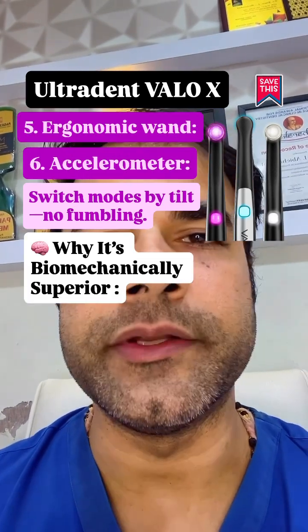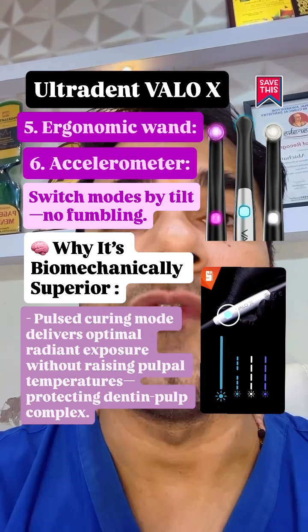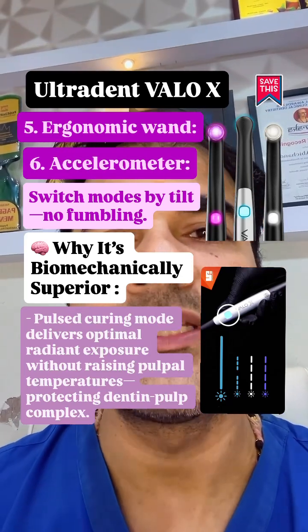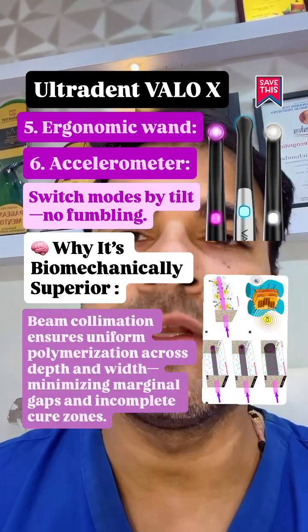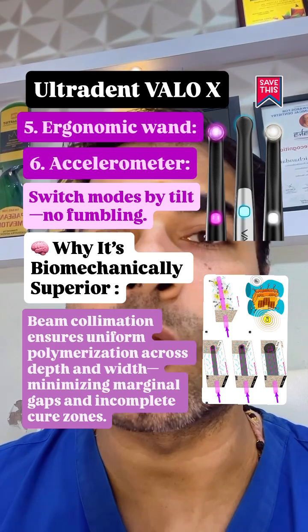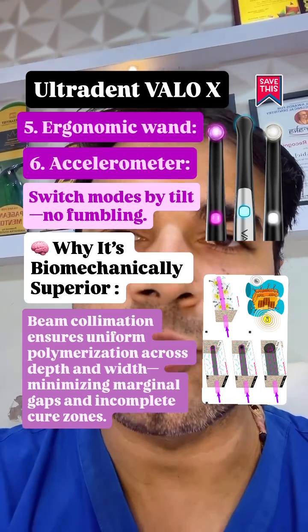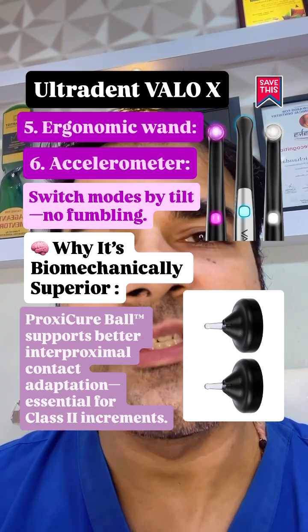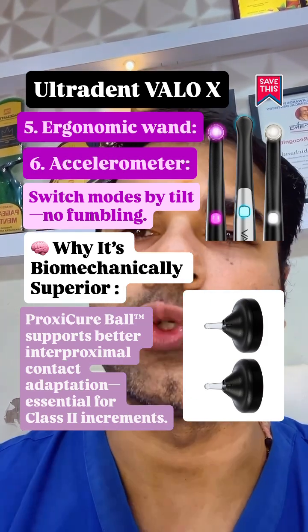Why it's biomechanically superior: pulsed curing mode delivers optimal radiant exposure without raising pulpal temperatures, protecting the dentin-pulp complex. Beam collimation ensures uniform polymerization across depth and width, minimizing marginal gaps and incomplete cure zones. Proxy Cure Ball supports better interproximal adaptation, essential for class 2 increments.